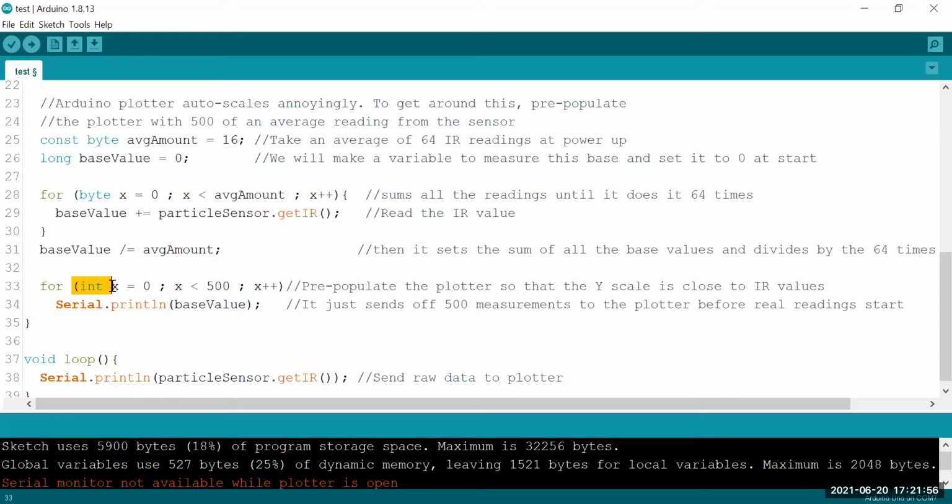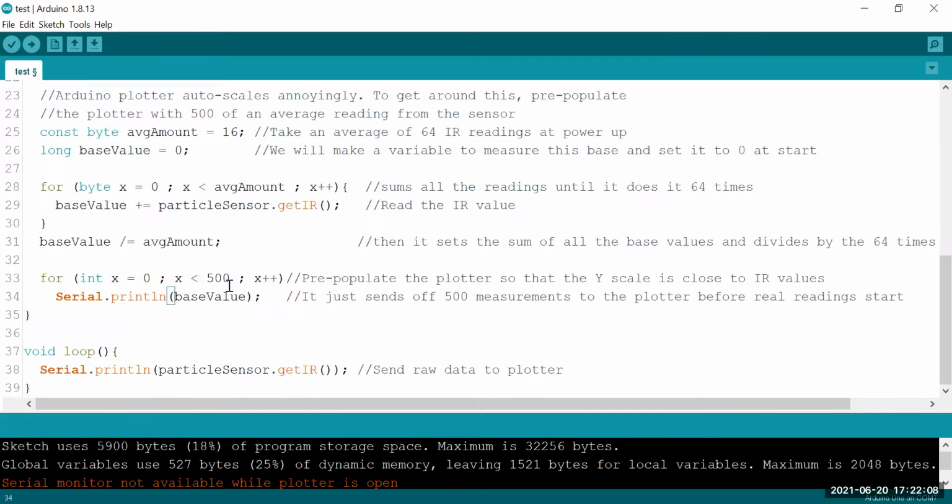Here's back to the Arduino. So this is what's going on. I'm saying some value for X, it's going to go up to 500 values and add 1 each time. That's what X++ means. So this is all in the setup. Note I'm not even in the loop yet.